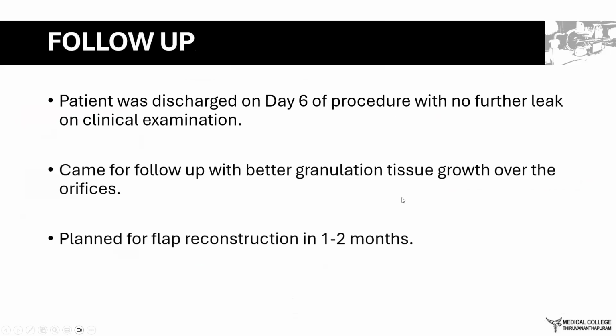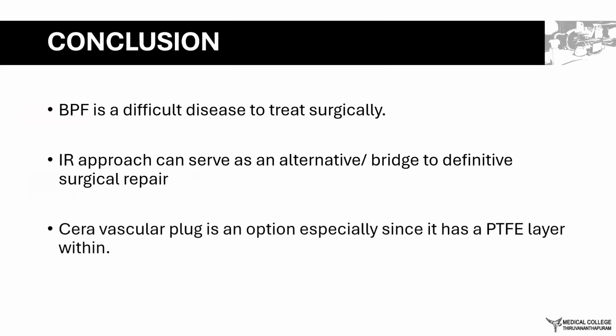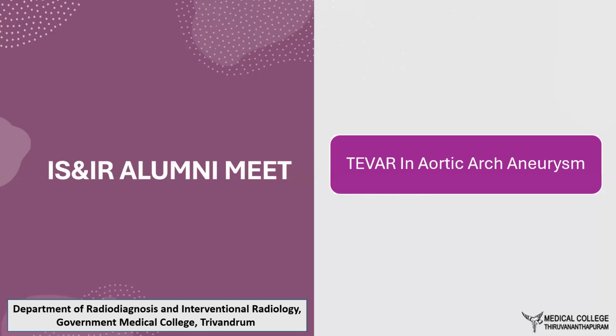The granulation tissue had regrown and the orifices have almost closed. There is one more skin opening that is left, which is pending for flap repair. So this, in selected cases, can be an interventional radiology option in bronchocutaneous fistula.